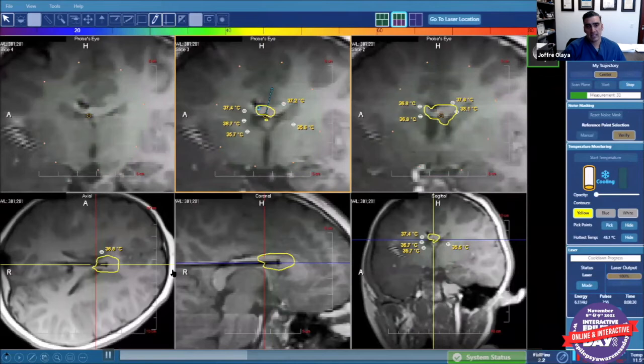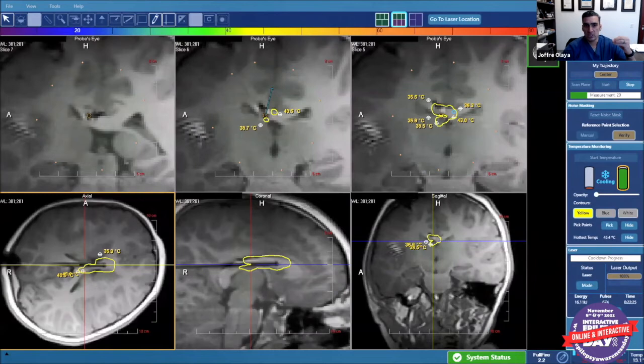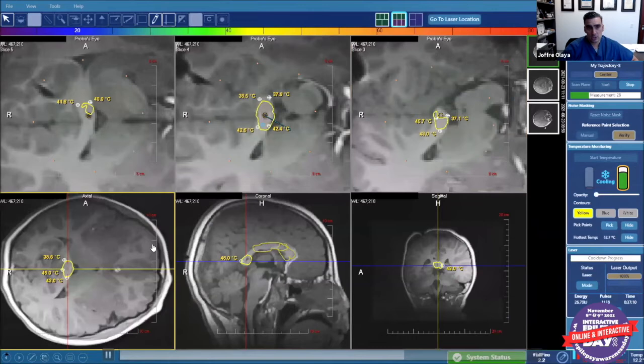And so again, we burn a certain part of tissue until it's completely ablated. Then we pull the probe back a little bit and continue to heat it until we get the entire extent in that trajectory. And so there, the body of the corpus callosum was ablated. Now this is the second trajectory. And so now we're getting the anterior, the frontal part, which is the genu or the rostrum. And then in this last one, we're looking at the images in the back part of the corpus callosum, which is the splenium, again, showing that tissue being ablated.